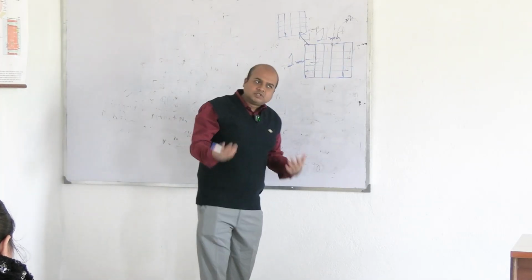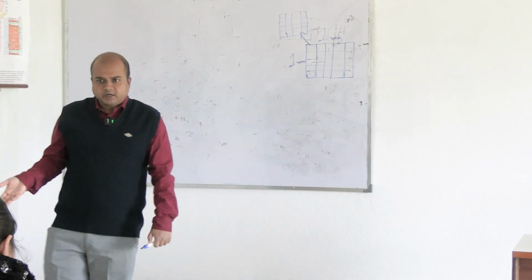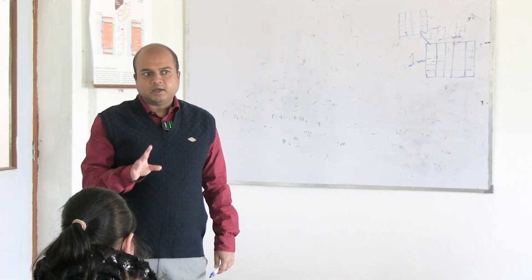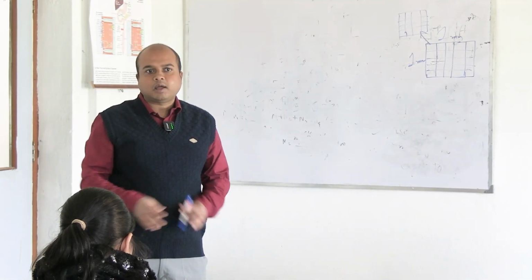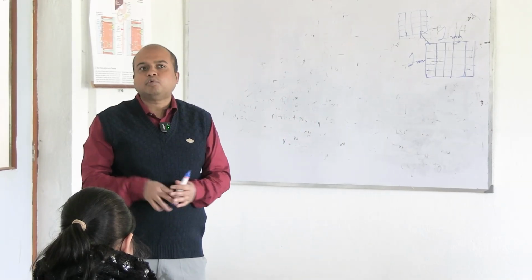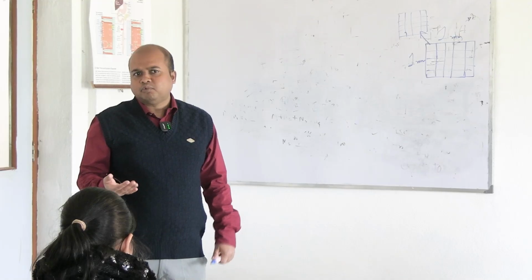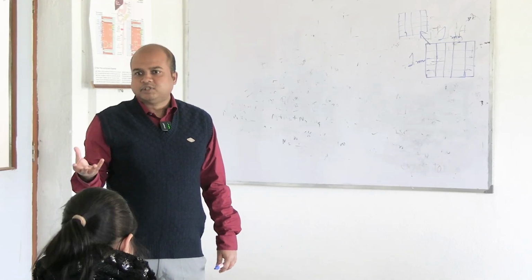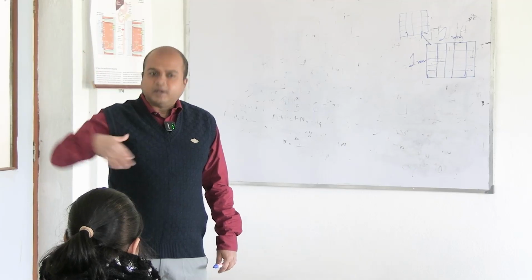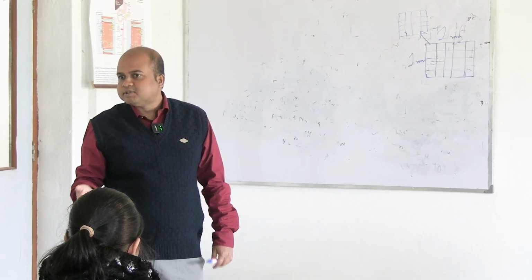Altogether, WBC counts are less, and the dilution requires only, say, 20 times. Even I think, that is my opinion, don't take my opinion, because the experiments have been done in the labs and the standard methods have come out. But my opinion is, we count the cells very easily in the case of WBCs, in the whole square. Few cells. Even if we by mistake, or deliberately, take blood up to 1, the dilution will be 10 times.